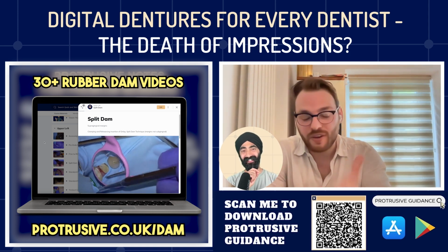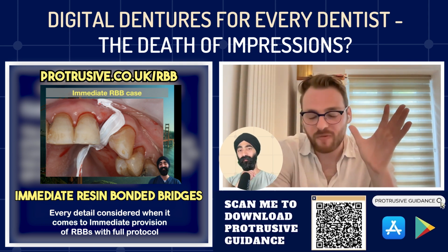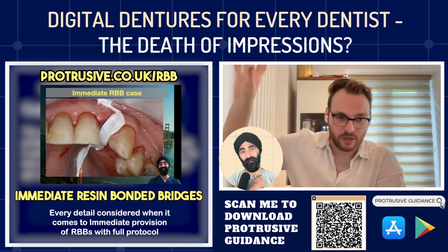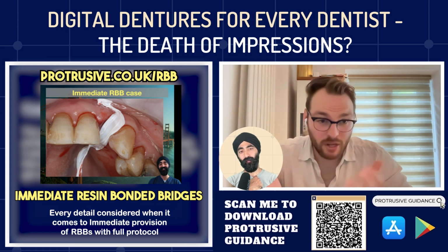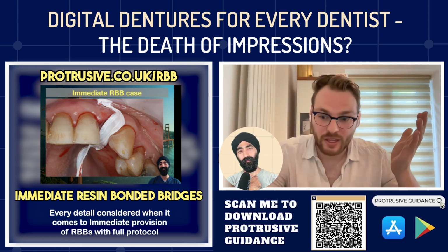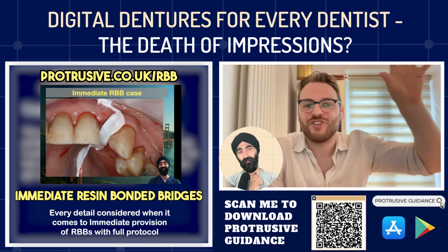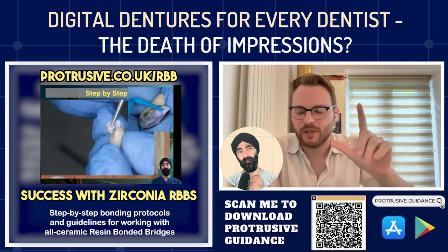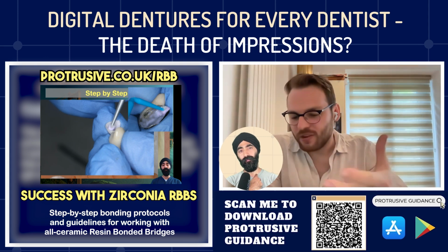If we verified it already, it makes no difference if that thing never returns or if it snaps in half, because they've got the file, they just mill it or print it again. So for those kinds of cases, you can say, we're at the definitive wax try-in now. We've still done our conventional impressions. We haven't done wax rims because we've done a reference denture. But we're going to get the definitive try-in now.